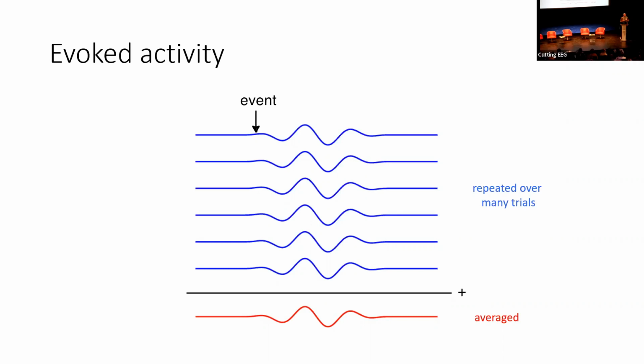Your individual students will still have different cortical folding, which means that even if the cortical response is exactly the same, the way it shows up in your EEG is still going to be different. So the between-subject variance is not the same as the within-subject variance.